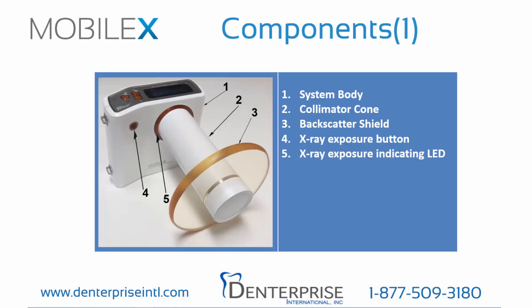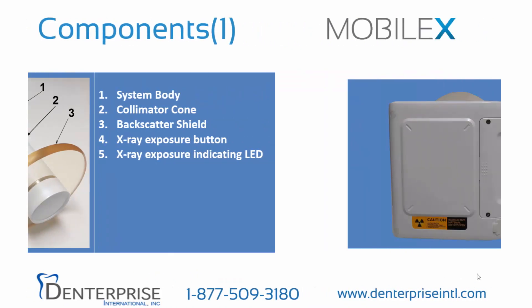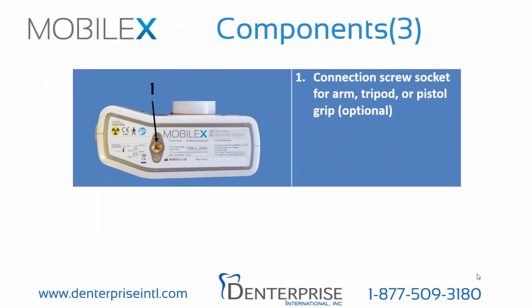Now let's take a look at the major components of MobileX. First, the system body. Second, a fixed collimator cone. Third, a fixed backscatter shield. Fourth, the X-ray exposure button. And fifth, the X-ray exposure lamp. On the reverse, we can see first the battery cover and second, the battery charger connection port. On the bottom, we see a connection screw for an optional arm, tripod, or pistol grip.